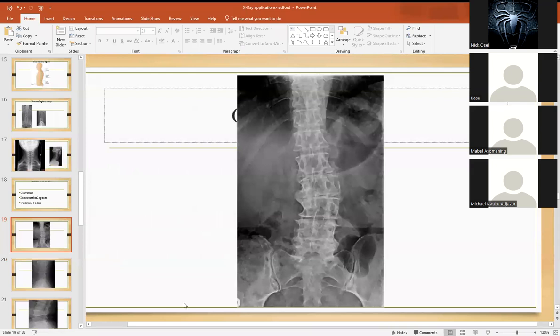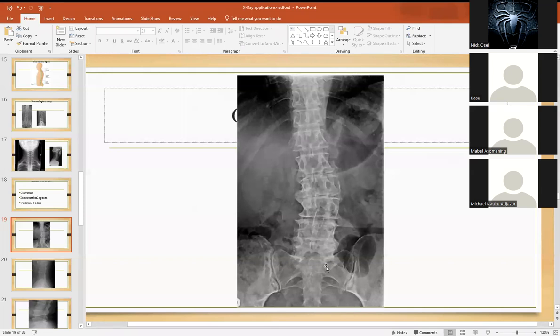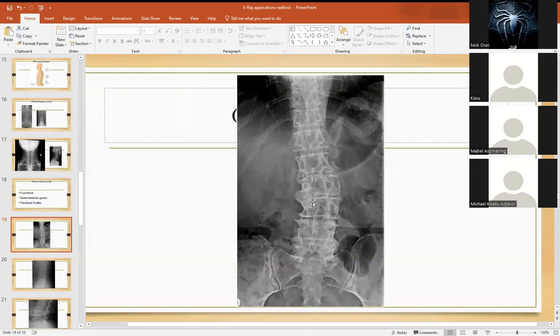Looking at this X-ray of someone's spine — this is the pelvic bone, and we are looking at an AP view. You can tell that this spine is crooked — it is not straight. This is scoliosis. If you watch closely, you realize that the vertebral spaces are flattened out. Counting from the pelvis: this is L5, L4, L3, L2. Between L3 and L2 on the left side, you can see that the space is almost absent — the bones have come together.